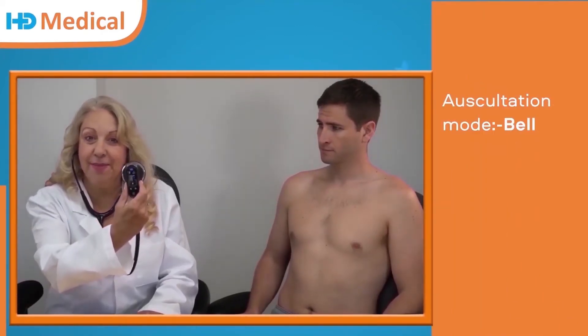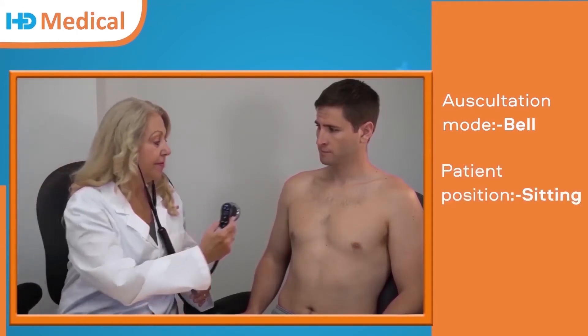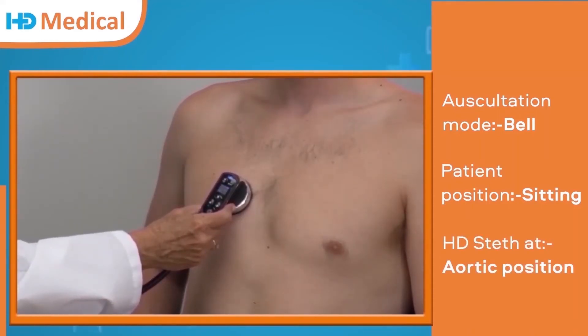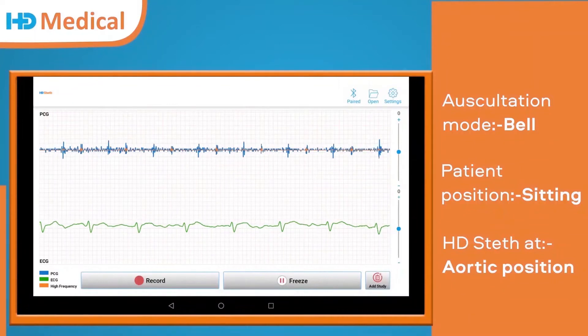Now we are going to go through the workflow for the different auscultation positions. The auscultation mode is in Bell. The patient is sitting. This is the aortic position. This is the auscultation waveform.